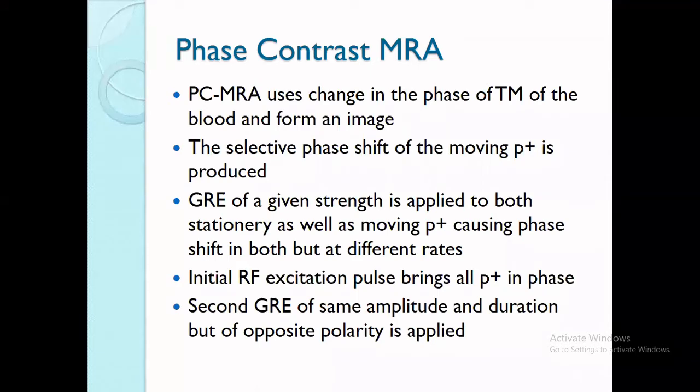While applying the second GRE of the same amplitude and the duration as well, two things are very important. Amplitude, by amplitude we mean the strength of it. For example, are you applying +1, +2, or whatever you want to do. So the amplitude should be the same as well as the duration, for how long you are applying, for how much time you are applying.